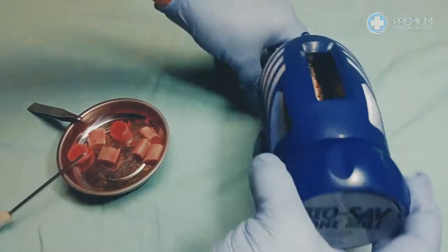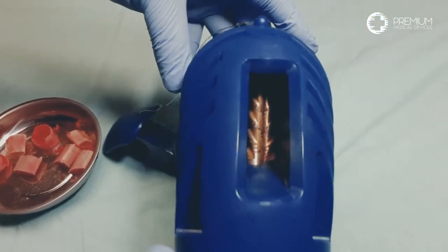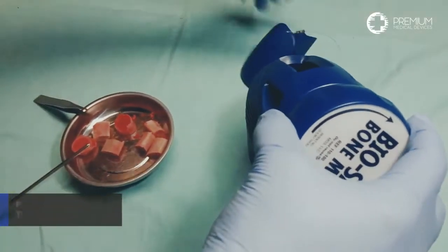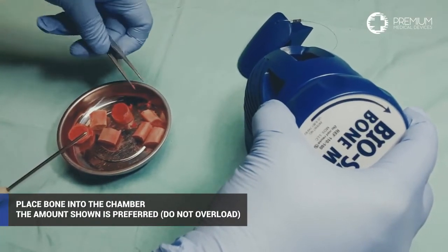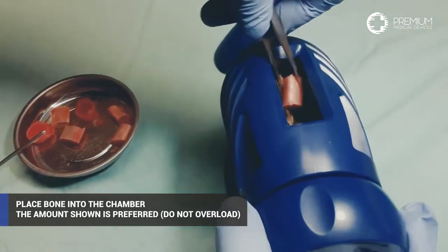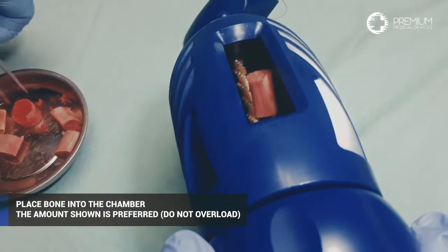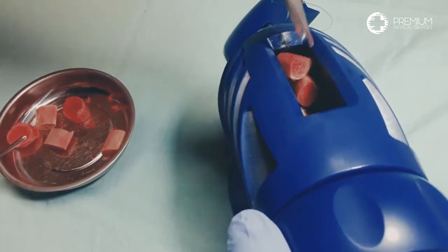Prior to placing bone into the bone mill chamber, look to see that the chamber is unobstructed. As we transfer bone to the mill, notice we are only placing two large pieces in the chamber. It is important that the bone mill operator not overload the chamber; the amount shown here is considered a good amount to process.